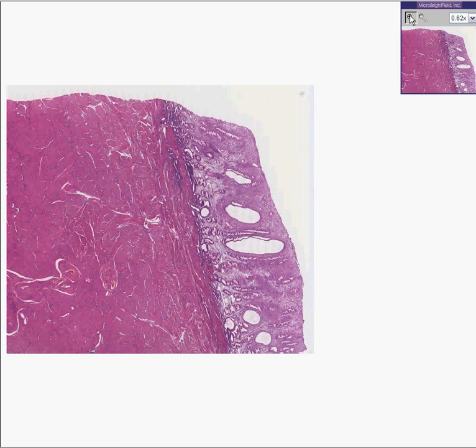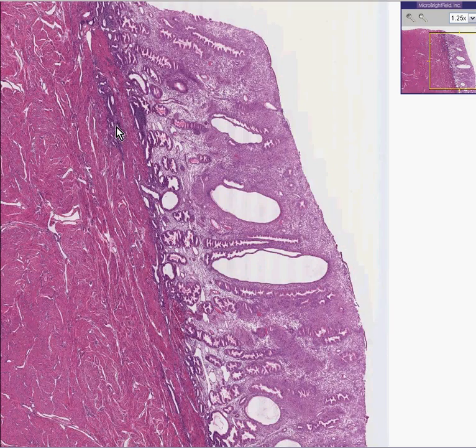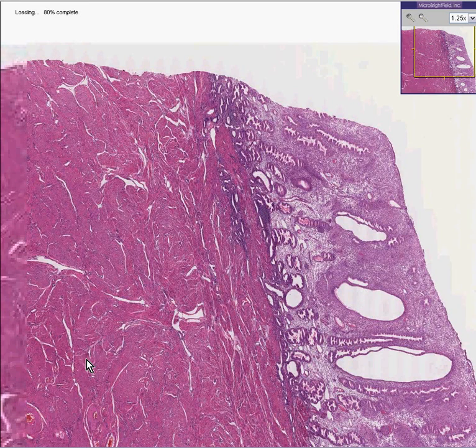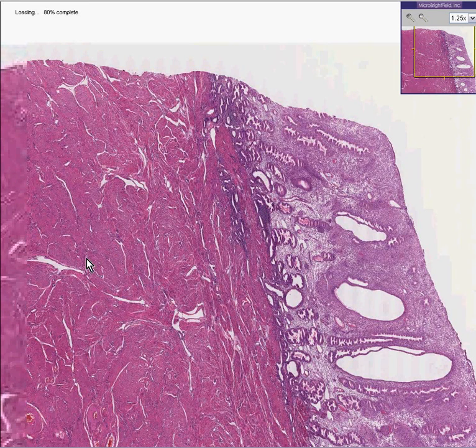If some of these glands were deep within the myometrium, you could call that adenomyosis. We could look at the normal histology of smooth muscle again, but you're bored with that, so I don't think we'll do it.